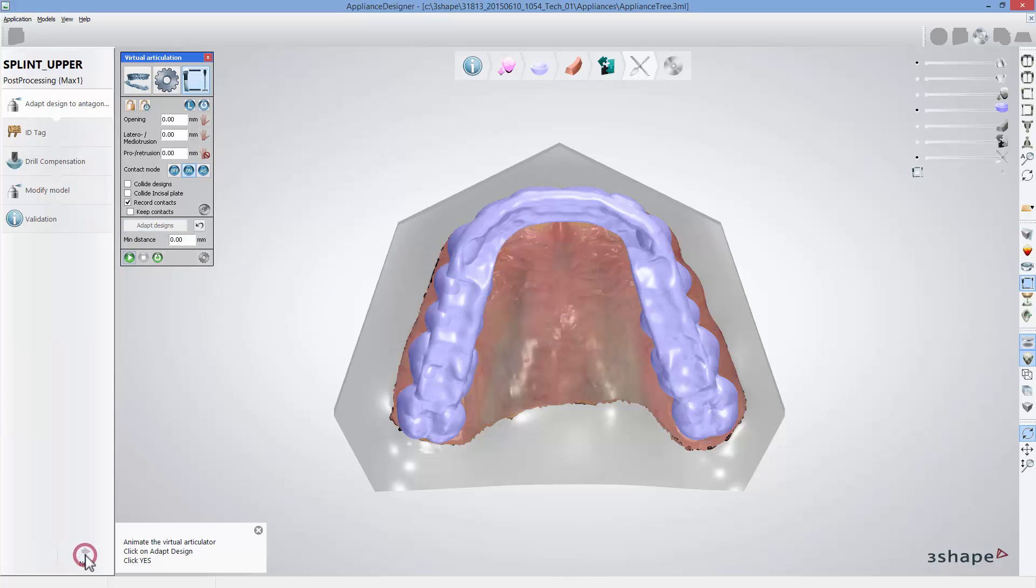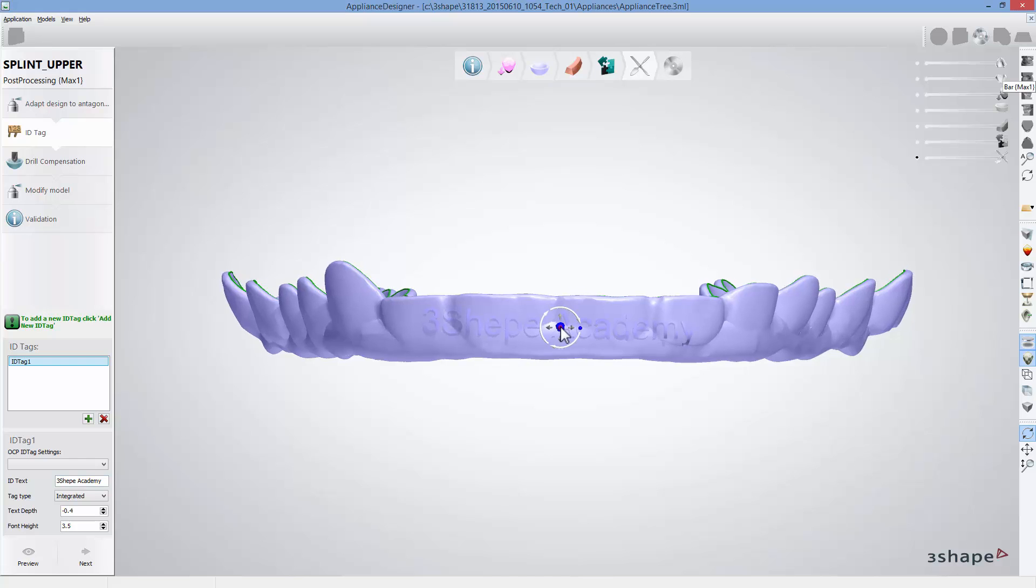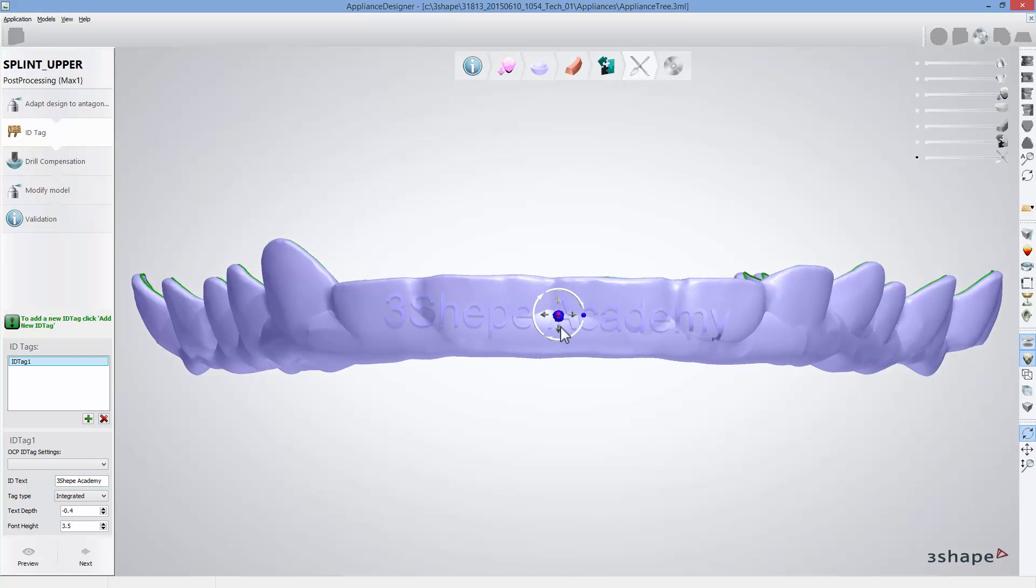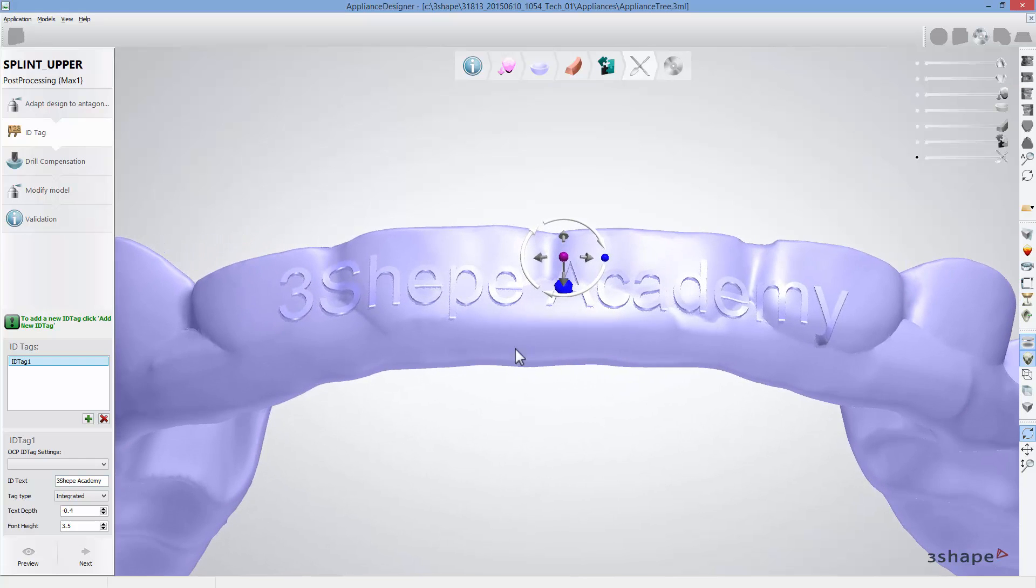After that you can add integrated or detachable ID tag and set all its parameters. All ID tag options are available in the settings menu.